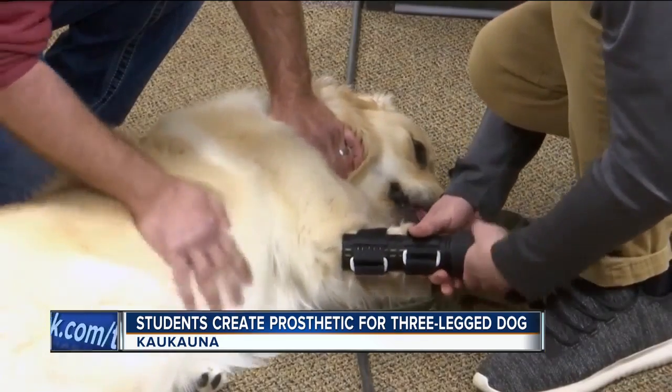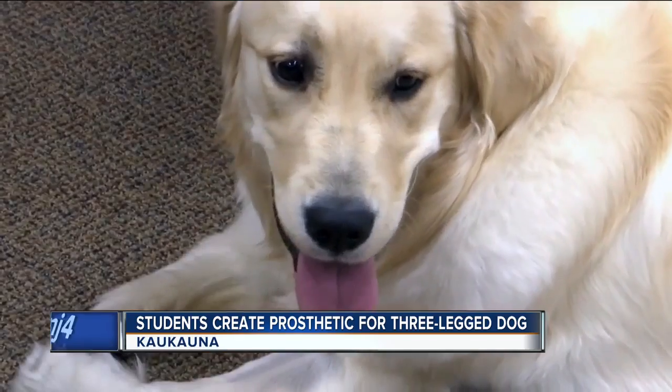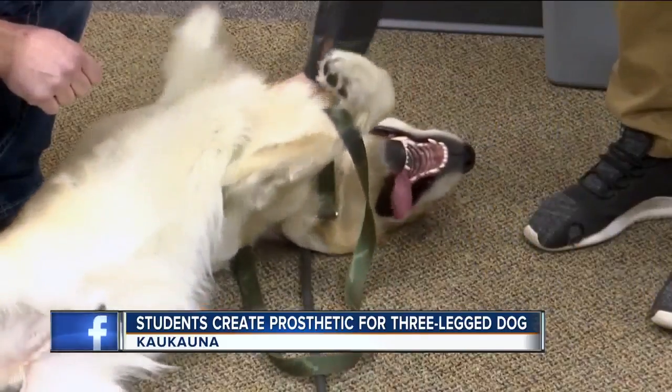The project started five months ago, and students hope with a few more tweaks, Gray's tail will be wagging because she's enjoying her brand-new leg. The comfort isn't quite there yet, so we're still working on that. But we're definitely getting closer to the end, and we have to get it approved by a small animal vet first, just to make sure that it's safe and it's not going to affect her limbs. But we're very hopeful that it'll work pretty well.